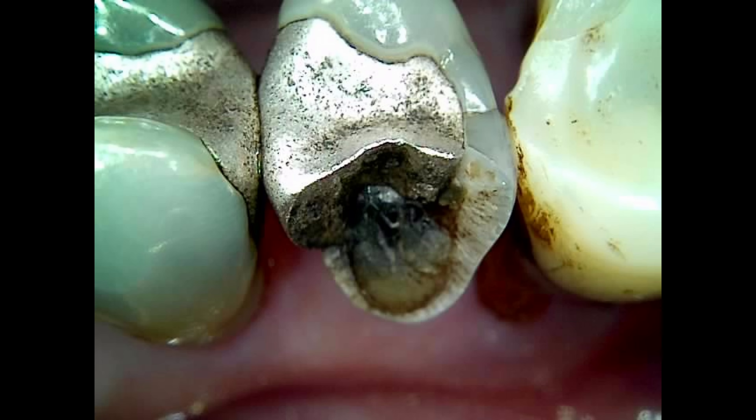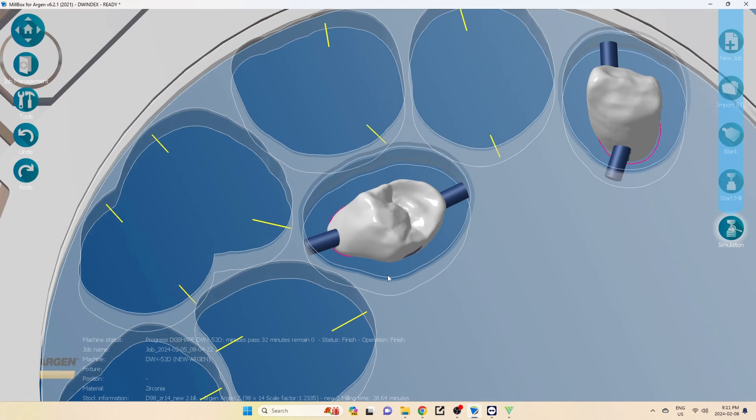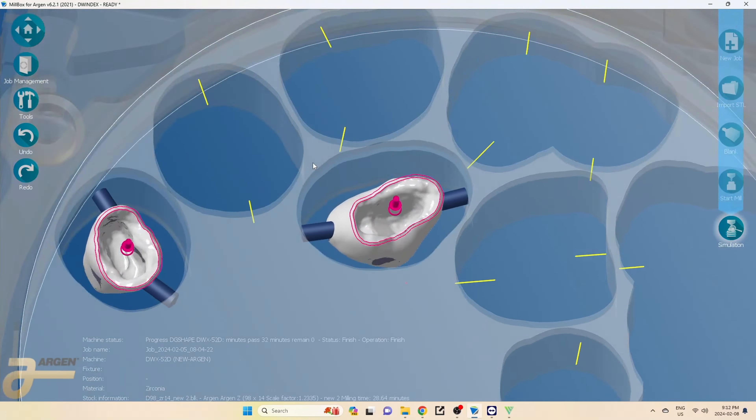Hey guys, Dr. Dobson. Happy Super Bowl Sunday — go Chiefs! In this one, we're going to be repairing a fractured upper right second premolar. We're going to go over the prep, the scan, the nesting process, and then the in-house manufacturing with our milling machine before we get the patient back to cement.